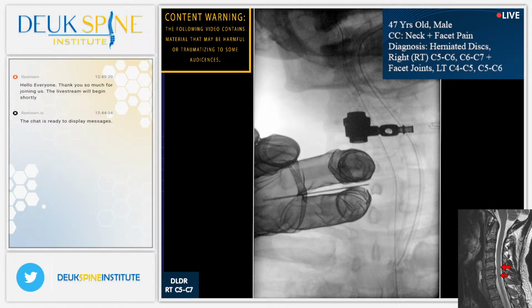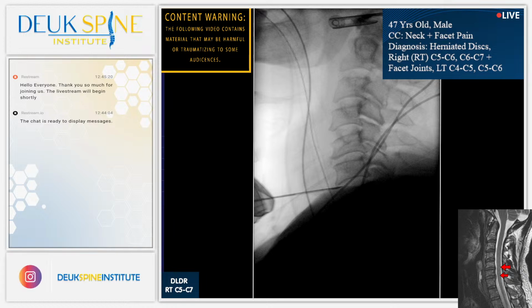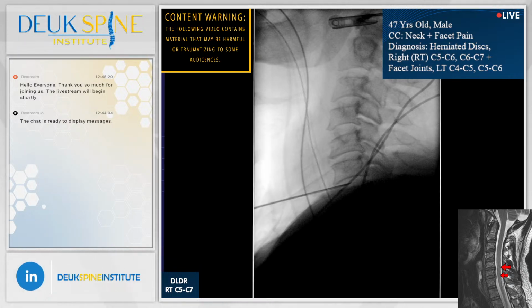So I'm using my fingers to deflect the trachea and esophagus over and away from what I'm operating on. Shot. Can we move those wires, please? 2, 3, 4, 5. They shouldn't even be there. I don't know why we're not paying attention to that. In general, we should be removing the EKG wires from the field of view.